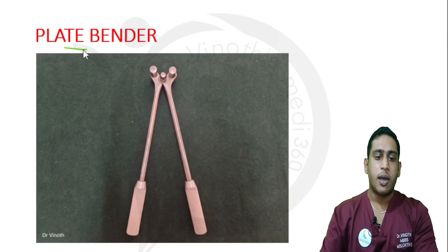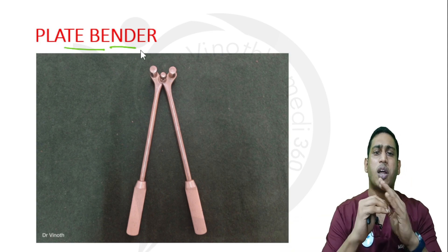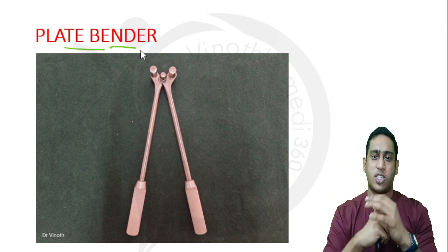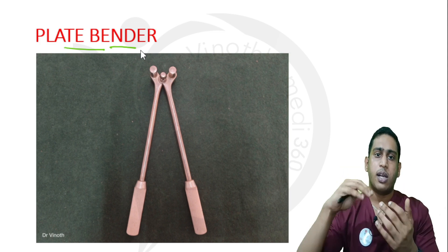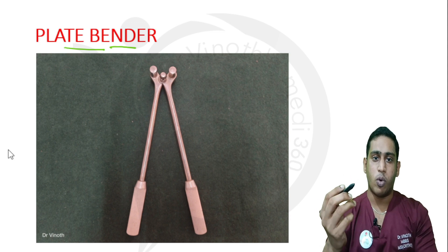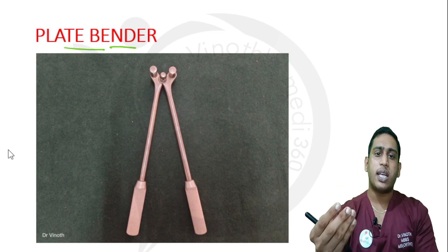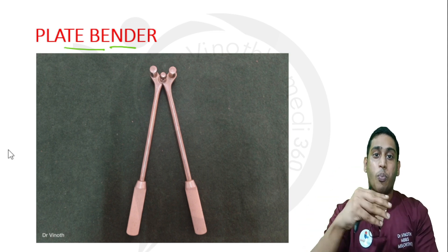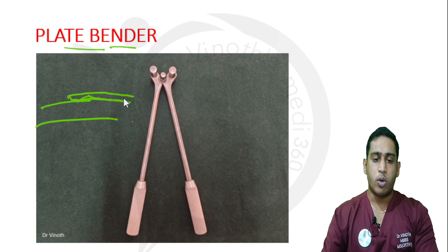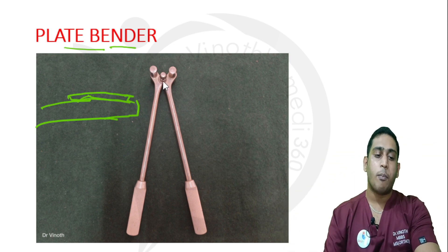The next instrument is the plate bender. Some bones are not straight — for example, the femur is curved in the anterior aspect. To match the contour of the bone, we need to contour the plates as well. Newer plates are already anatomically contoured, but if you are using a simple plate like a DCP plate, you need to contour it to match the angulation of the bone. This instrument is used to bend the plate, and it is called a plate bender.